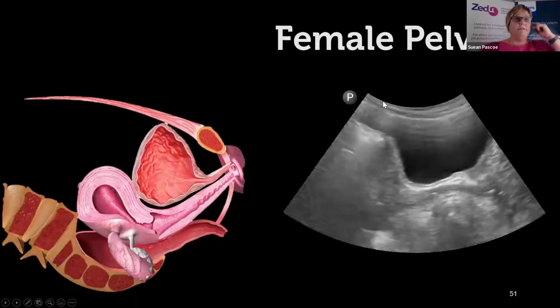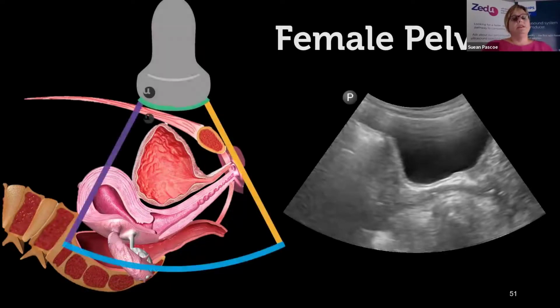Now the pelvis, my top tip here is put your probe in longitudinal. Slide the probe down so that the bottom of the probe butts up against the symphysis pubis, and then point your probe directly to the floor. When you do that, directly underneath the probe will be the bladder, and deep to that will be the uterus and vagina, which makes like a Nike swish sign or a tick sign. That's kind of like an arrow pointing to where the free fluid is going to collect posterior to the uterus.